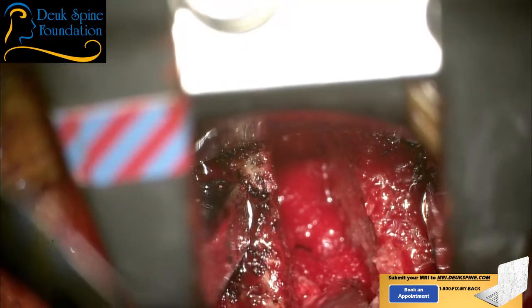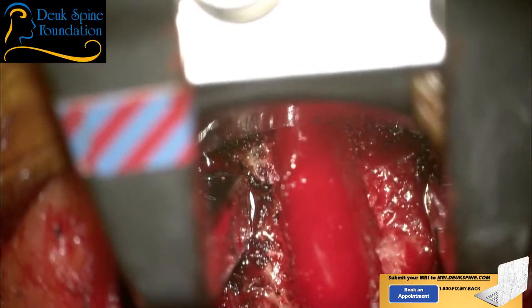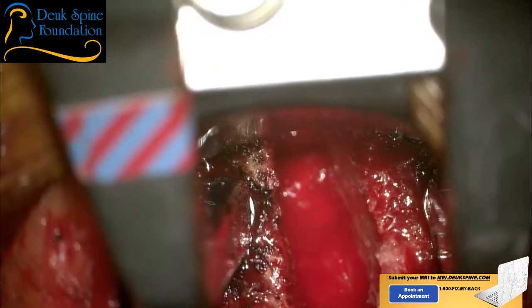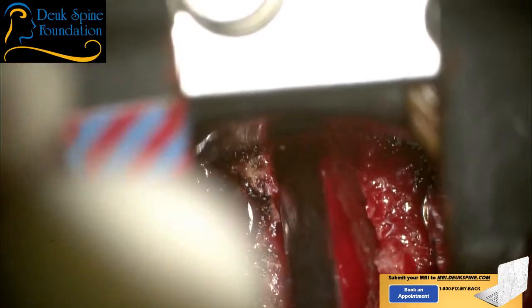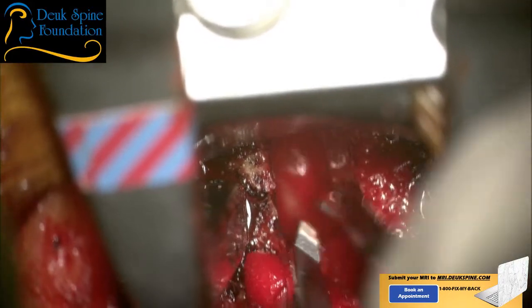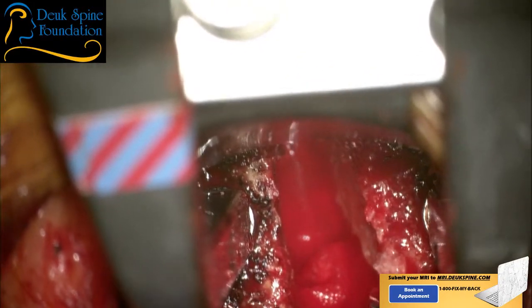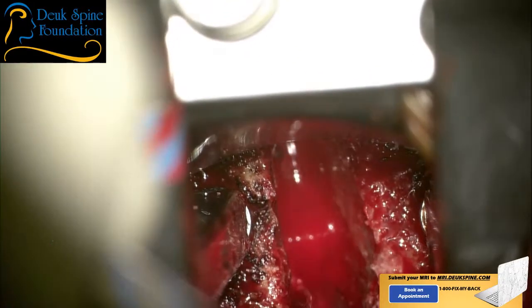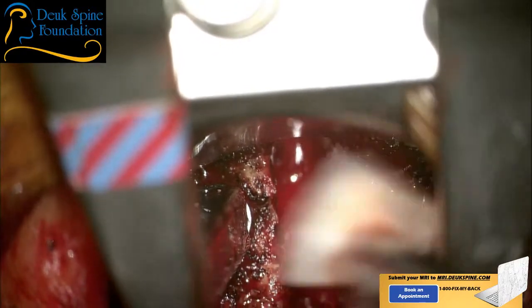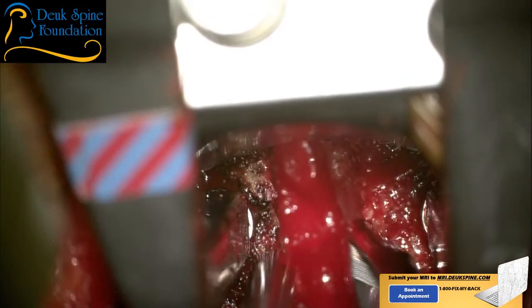All right, so these tools we're using, these thrombin and gel foam, you can't put them on top of blood clots. So you have to aggressively suck the blood clots and put them on top of the bleeding veins. They don't work when you put them on top of blood. They only work when you put them on top of bleeding veins. A lot of doctors don't know that and understand it, but it's a fact.